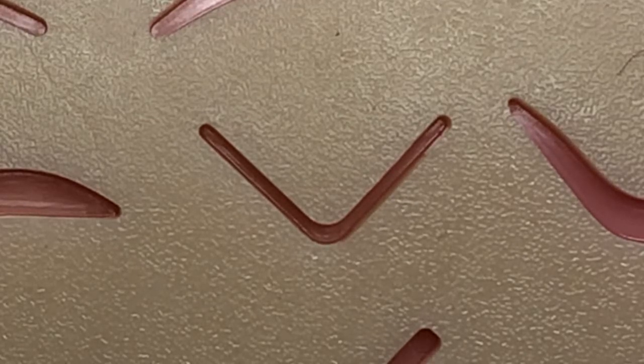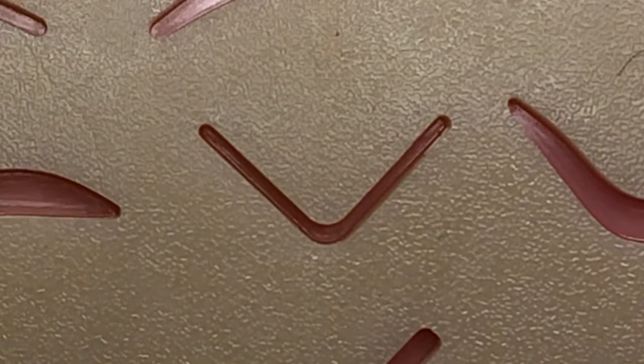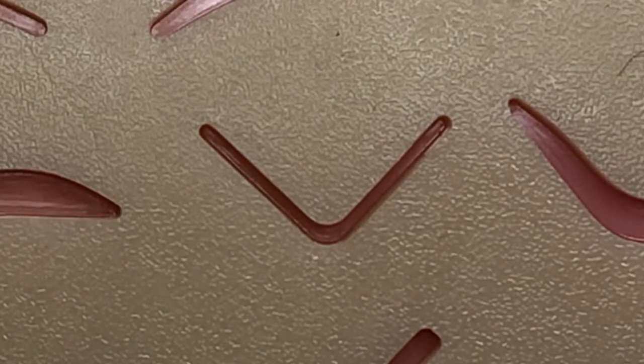Hey everybody, it's Dr. O'Malley with the laceration course. We're going to talk about something that you see on occasion, and that is your V-shaped laceration.